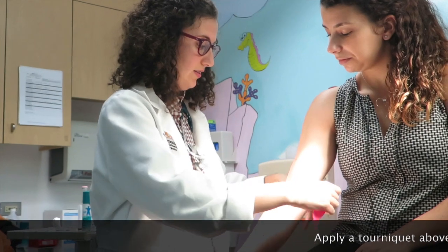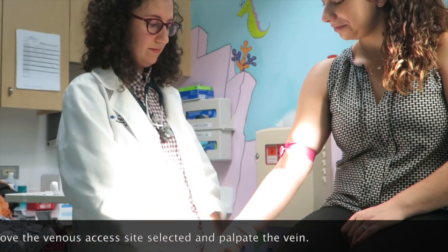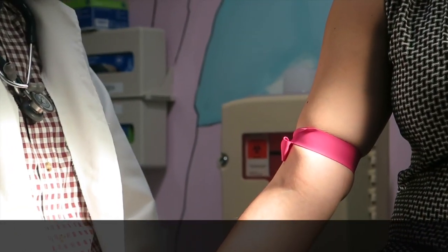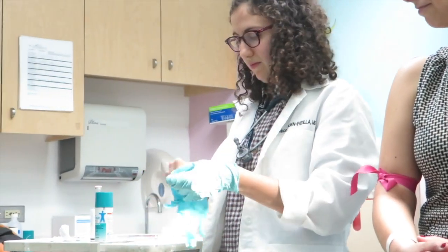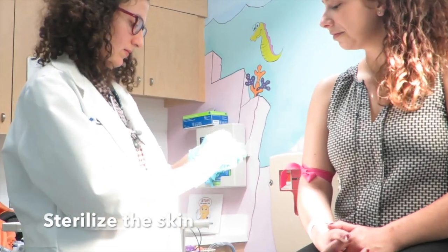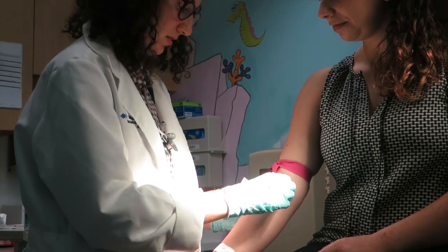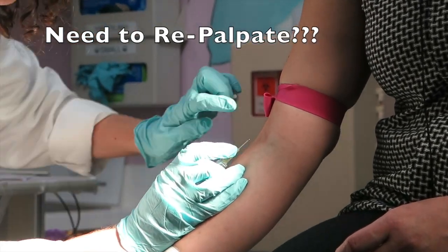Apply a tourniquet above the venous access site selected and palpate the vein. Put on non-sterile gloves. Sterilize the skin — friction during cleansing and adequate drying time is critical to eliminating organisms on the skin. If you need to repalpate your vein, make sure you stop and re-sterilize before performing the venipuncture.